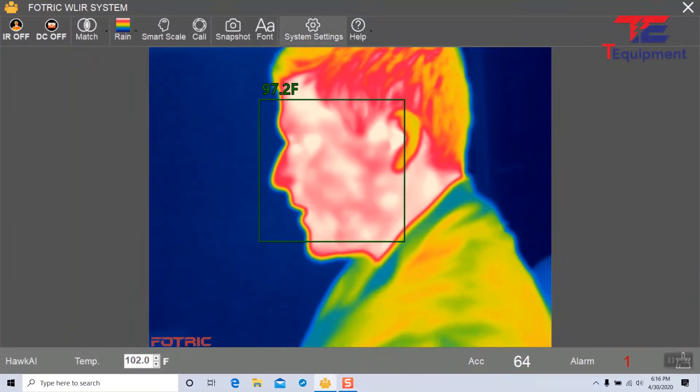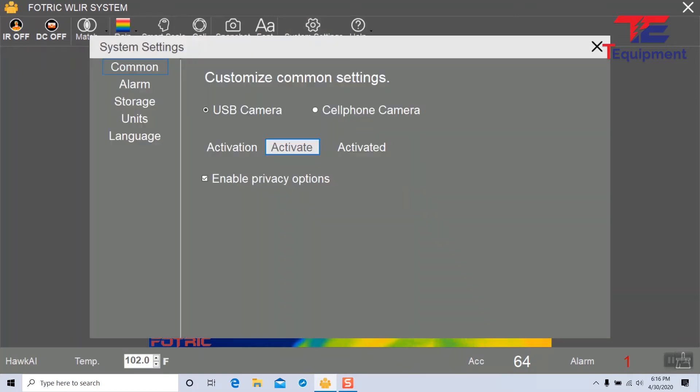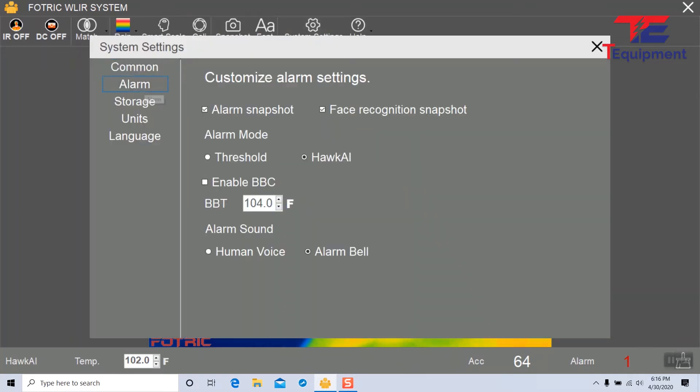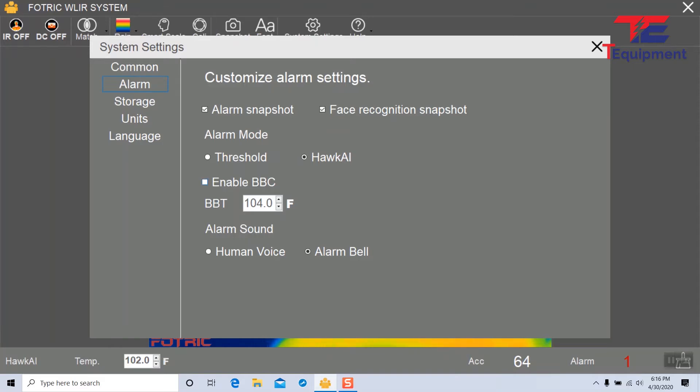The next option under alarm is to enable a blackbody. Blackbodies are great reference points that provide more accuracy for the readings, and this is where you can enable that. You can also set its reference point temperature right here.